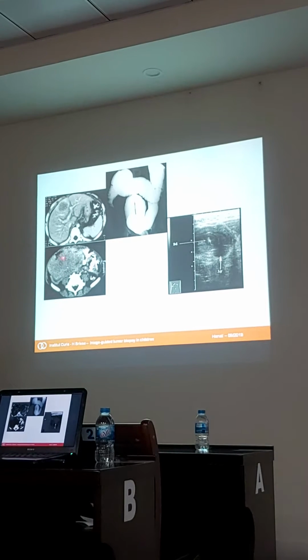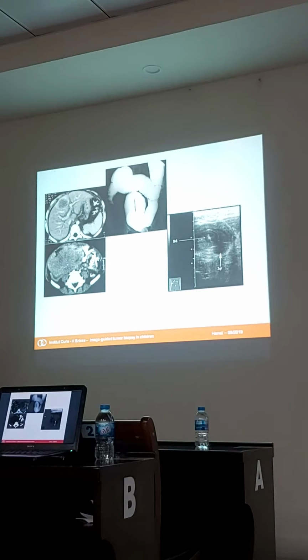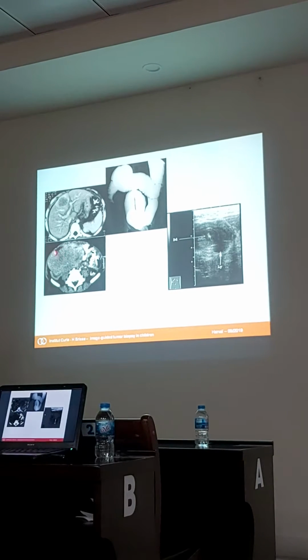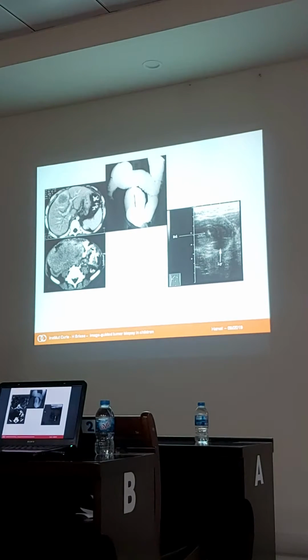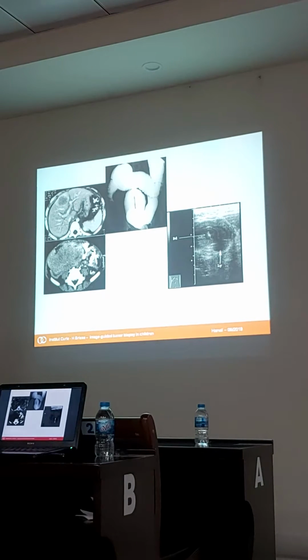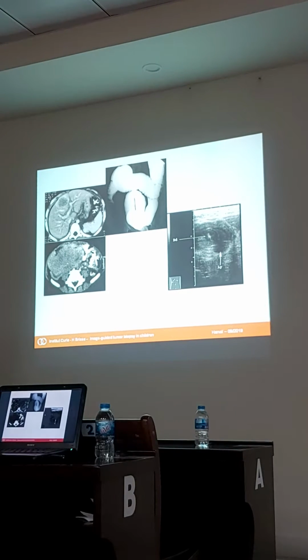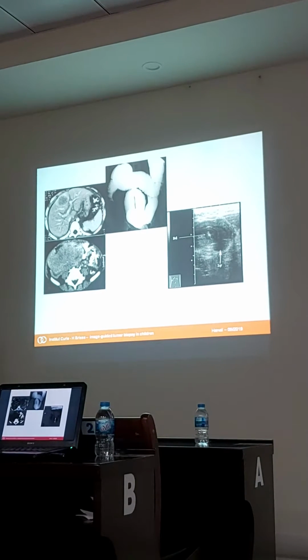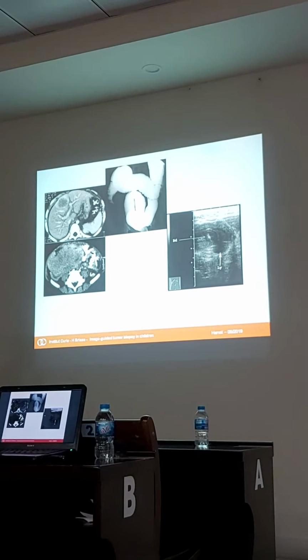There is a tissular mass which is obviously located in the bowel wall, okay? And there is some air inside, so it's a tumor of the wall of the bowel, with associated peritoneal diffusion and liver diffusion in a 7-year-old boy. So the most probable diagnosis is lymphoma, Burkitt lymphoma.